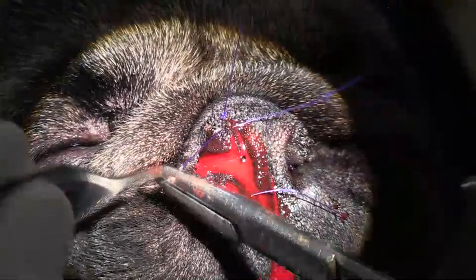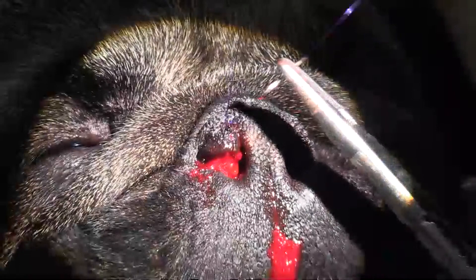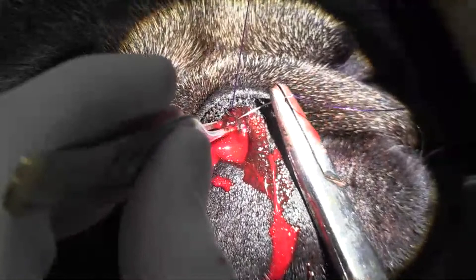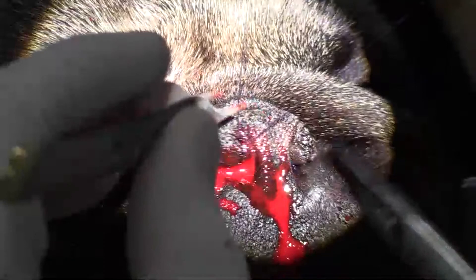There's a question about whether I'm using epinephrine to control the bleeding, and I am not. If I had bleeding that was really out of control I might think about it, but this amount of bleeding is really not that much. There's a saying: bleeding you can see, hemorrhage you can hear — and we definitely can't hear this amount of bleeding, so I'm not too worried about it.